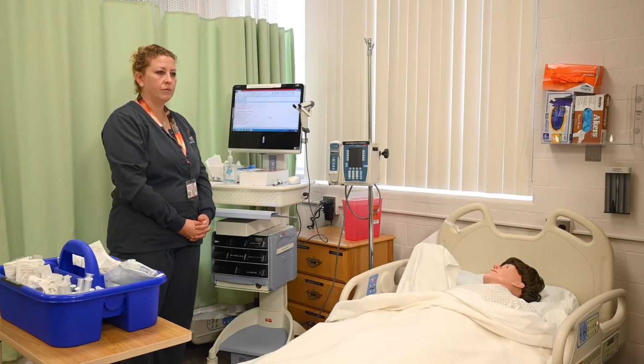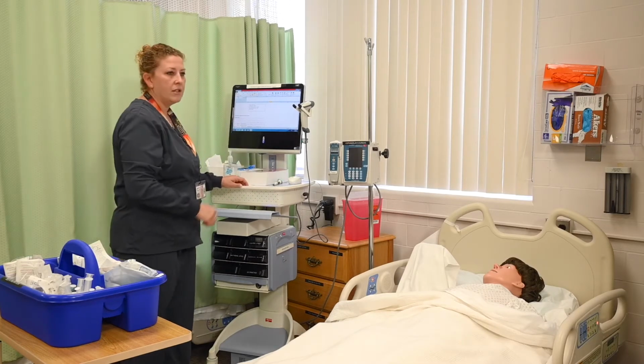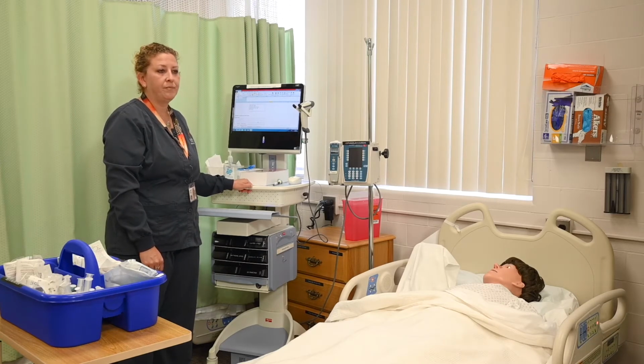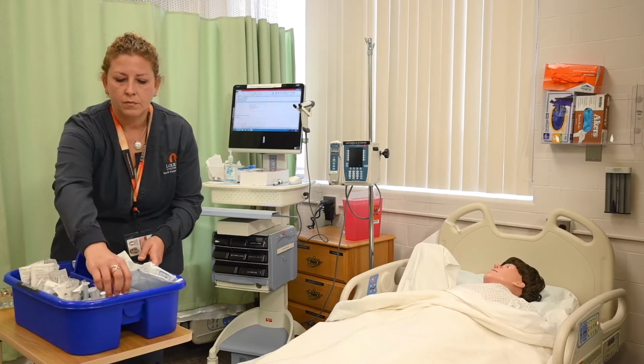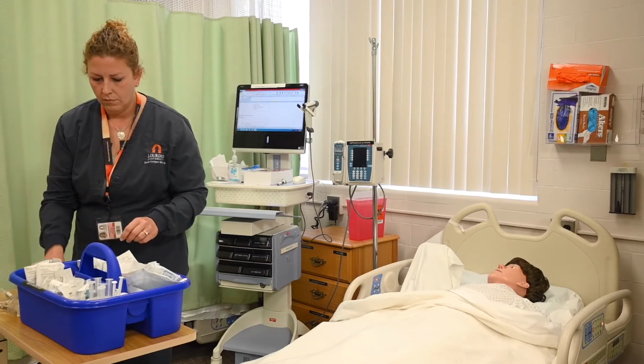Review the patient allergies. The patient is allergic to morphine and bananas, which will not affect our procedure today. And now gather the necessary supplies. Sarah will find the appropriate IV catheter.